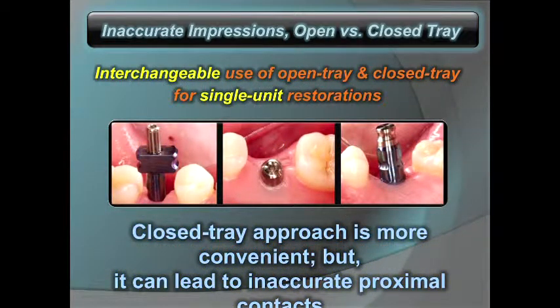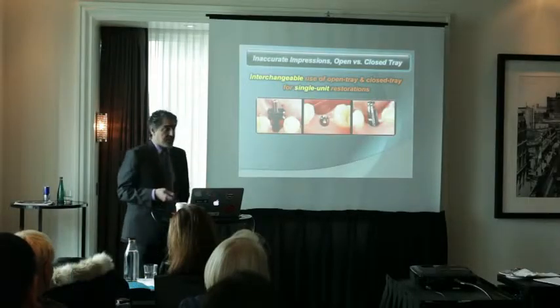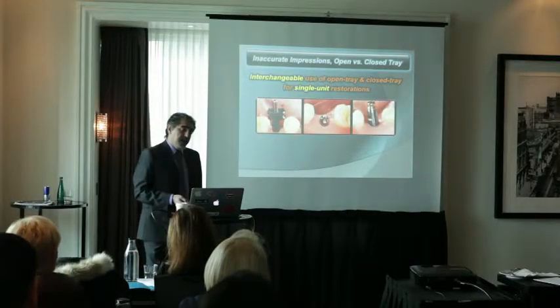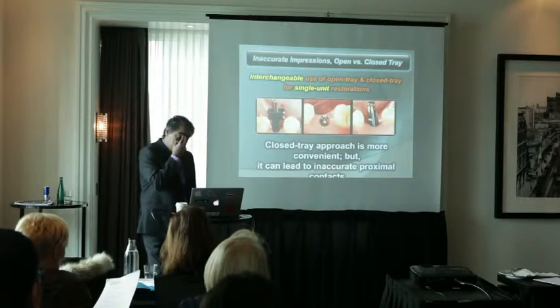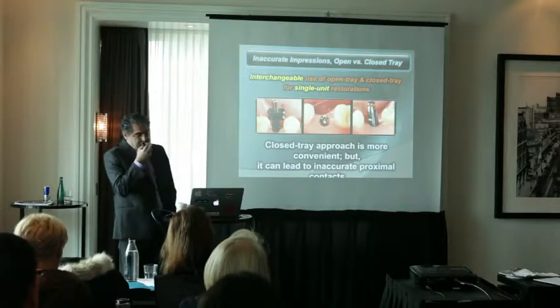However, I'm not one of those who would say that there is absolutely no room for closed trays and we always have to go for open tray. No, in many cases for single implants, there is no real clinically significant difference between the open tray versus closed tray. So for single implants, I would use closed trays.